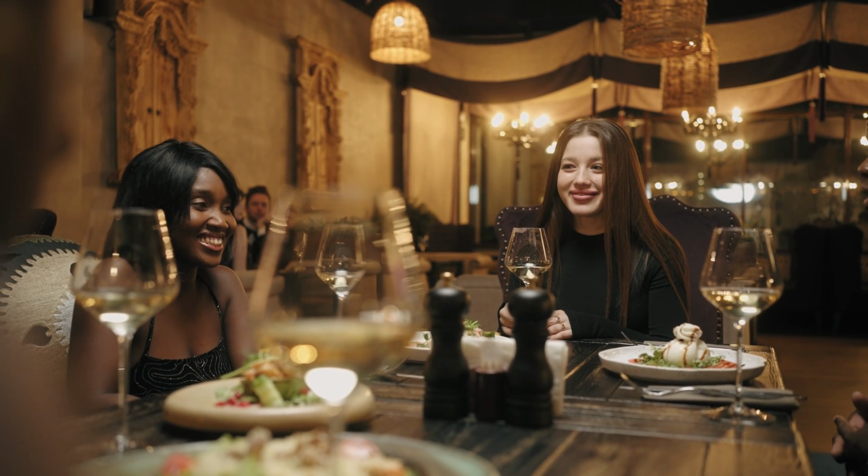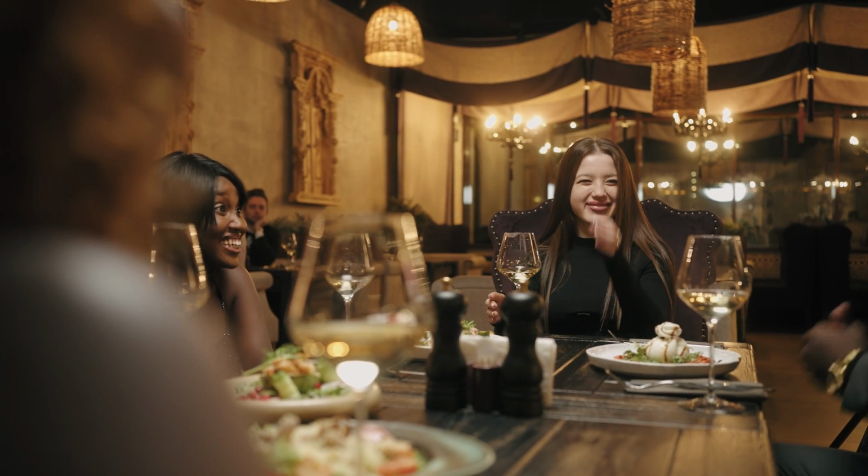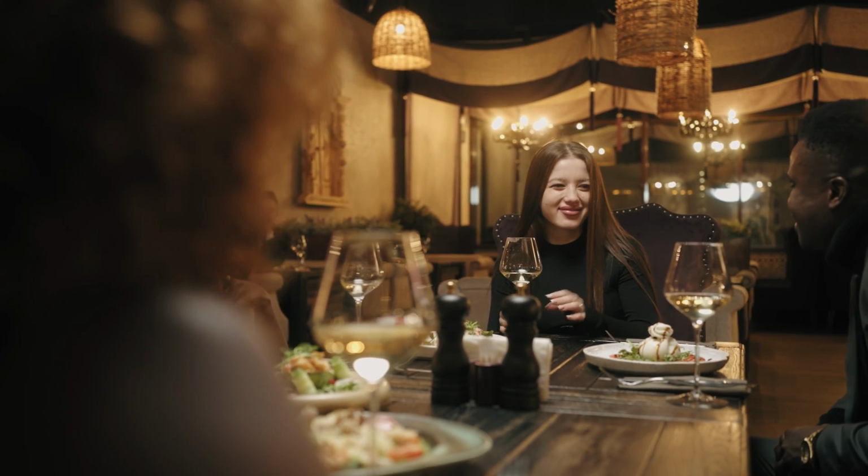and the hearing aids would need to react differently again, which is all done by the hearing aids monitoring their conversations, head and body movement, and the environmental noise. 3 scenarios with each person surrounded by the same background noise, but all with different needs. All I'll say is that these are some pretty big claims coming from Oticon, so I'm looking forward to fitting them in a few patients' ears and feeding this back to you guys watching.